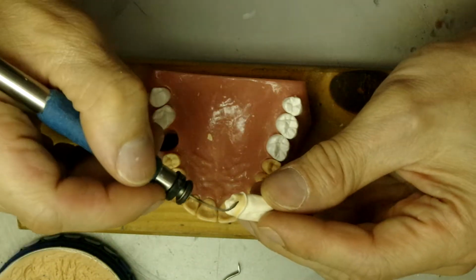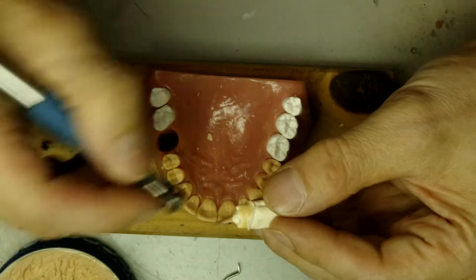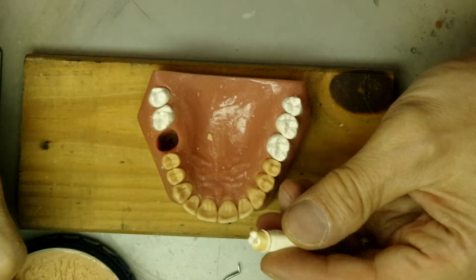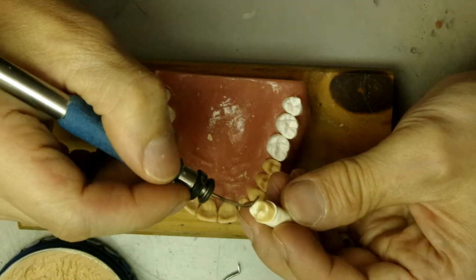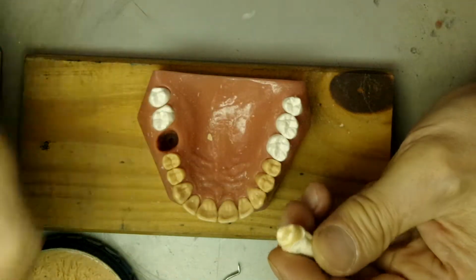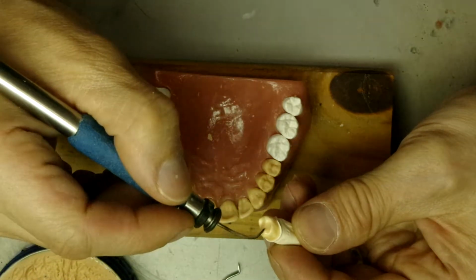As usual, we start waxing with the wax coping first. If you notice, I'm running all the way around in a circular direction. This kind of allows me to put an even layer on, so as we take the crown off, if we need to, it's gonna have a nice surface on the inside. It's not gonna have like little ripply effects.